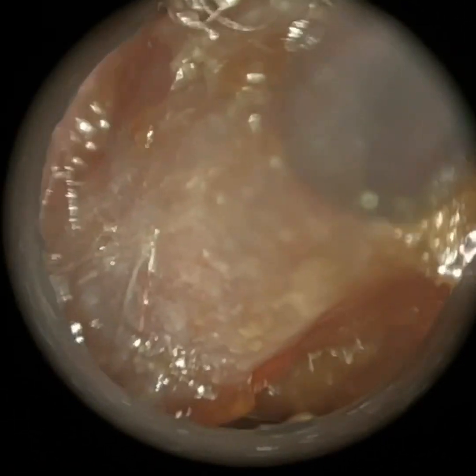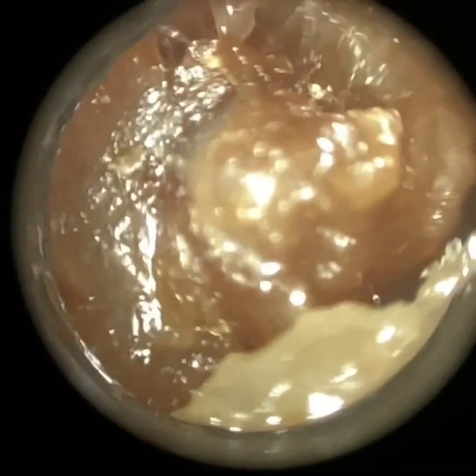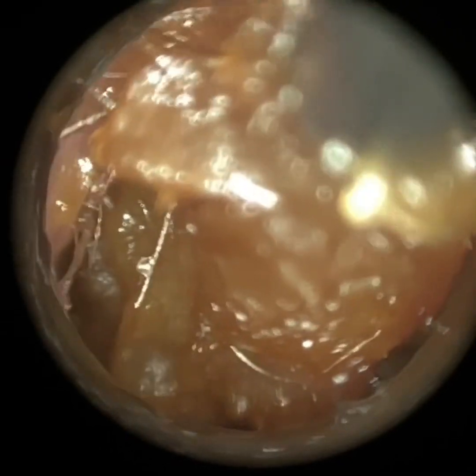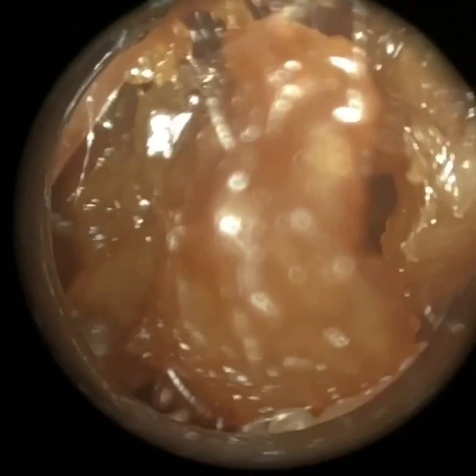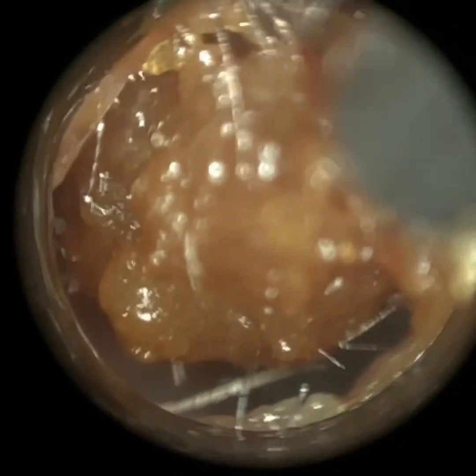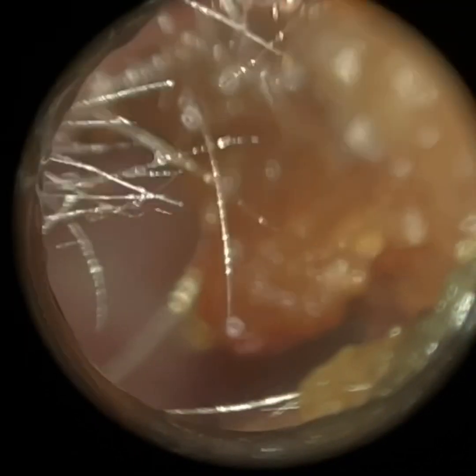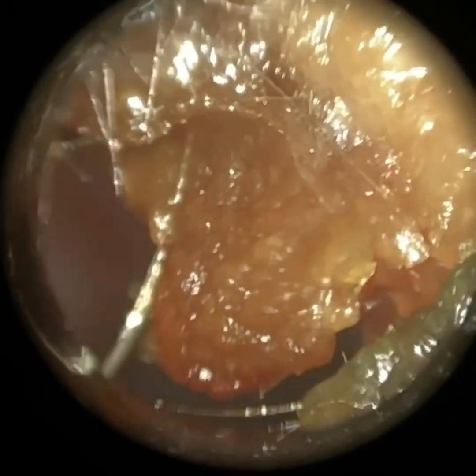Just got blocked again momentarily. I've managed to separate that plug but it's separated into two. The suction probe gets blocked on a couple of occasions here. It's just coming away — it's quite a loose consistency of wax. Instead of coming out in a singular plug, it's coming out in little sections. I'm just trying to bring it underneath again from that superior canal wall. That part of the ear canal is a bit narrower, and there's wax tucked in beyond it, more medially, so I'm trying to bring it underneath.